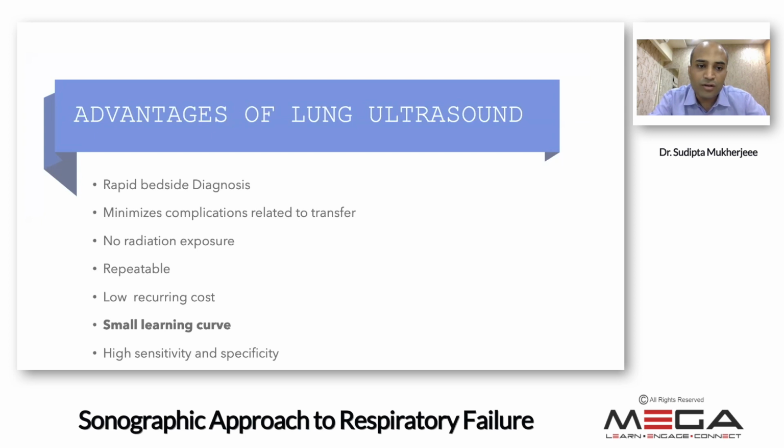And the advantage for ultrasound, we all know, it's a rapid bedside diagnostic test, minimal complication related to the transfer of the patient to the CT suite, no radiation exposure, so you can do it repeatedly, low recurring cost. Compared to the conventional belief, there is a very small learning curve, and it is highly sensitive and specific for diagnosing most of the clinical findings in our practice.